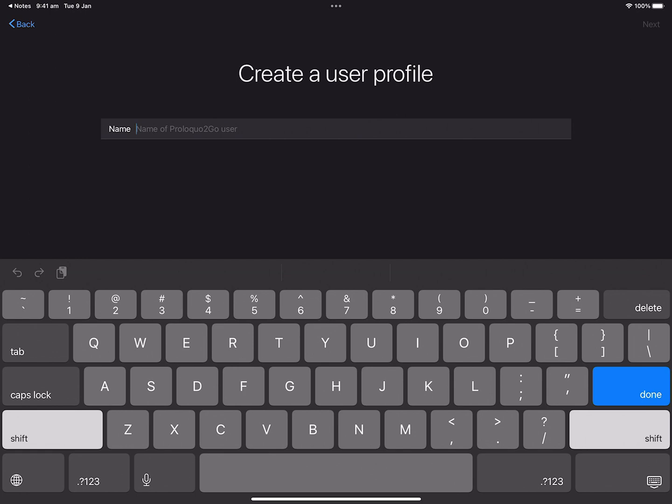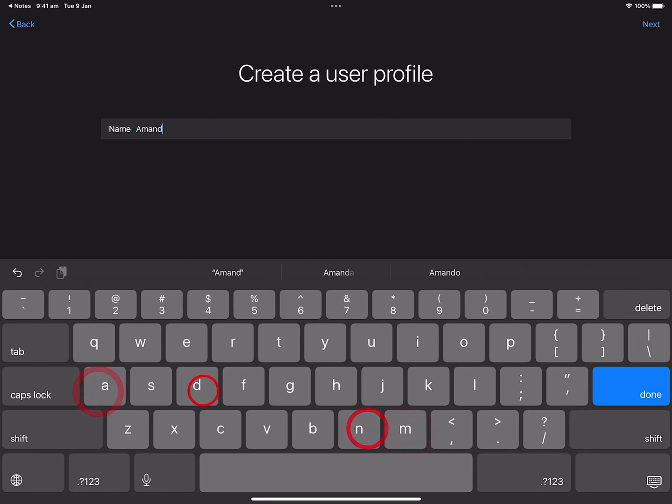Next, give the user a name. Today I'll choose my name, Amanda. Then tap Next.